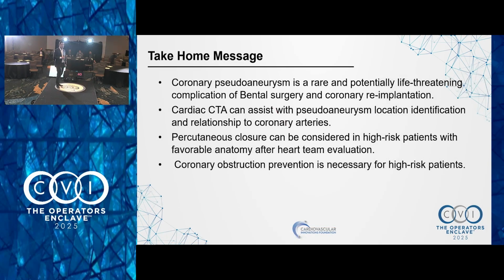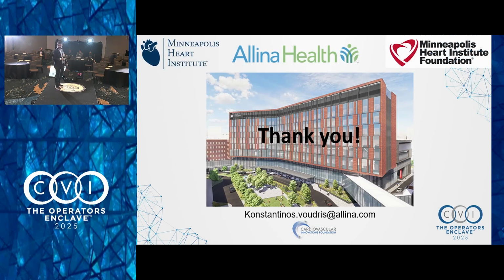I would keep this patient on anticoagulation, though. As Paul has said, she has a mechanical valve, so she's going to be on warfarin. That's the easy part there. I was going to keep her on Plavix and warfarin for some time. She's young. The good thing is that papyrus is 4.0. It's not a small papyrus, so hopefully with the anticoagulation, things are going to be easier.